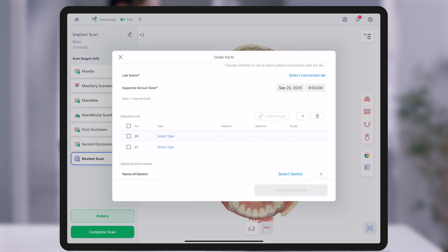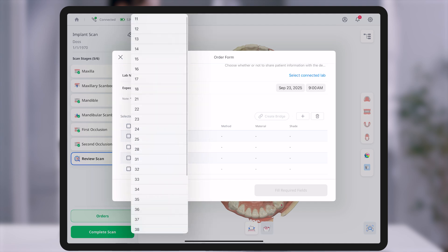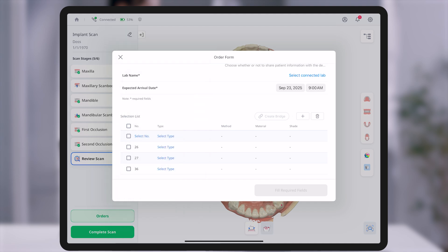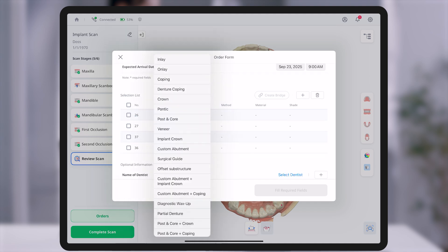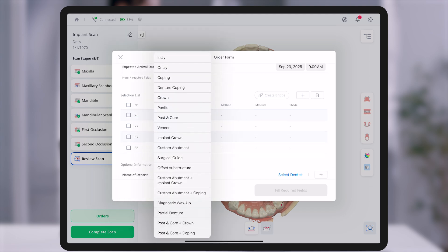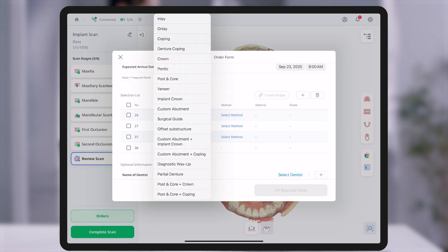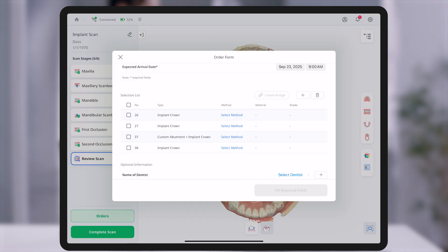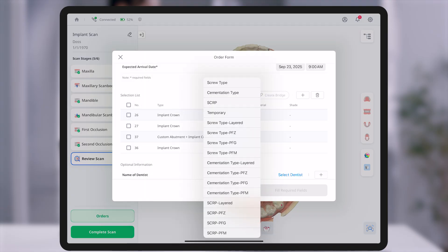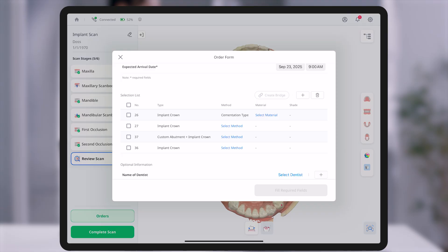In the order form step, you will enter detailed information necessary for prosthesis fabrication. Select the relevant tooth numbers based on the treatment plan and provide specific details such as prosthesis type, material, and shade for each tooth.